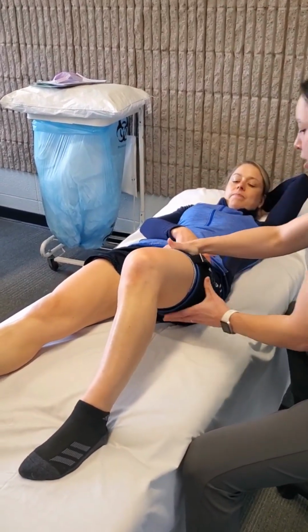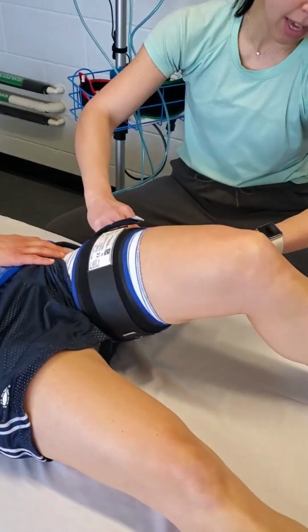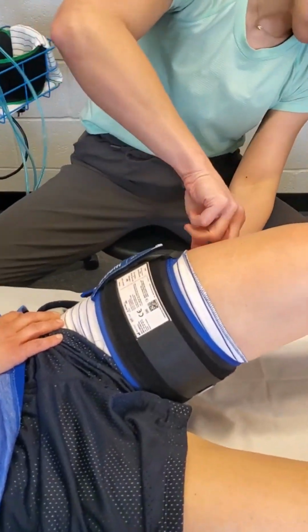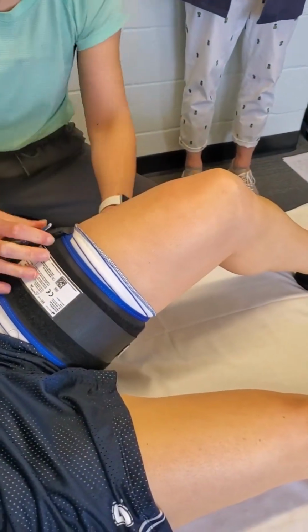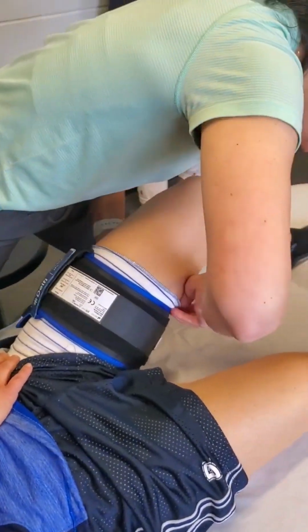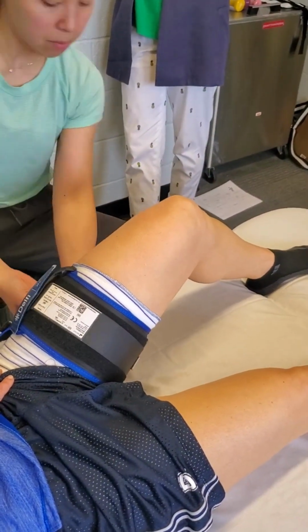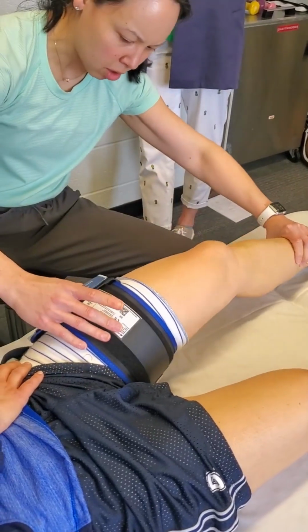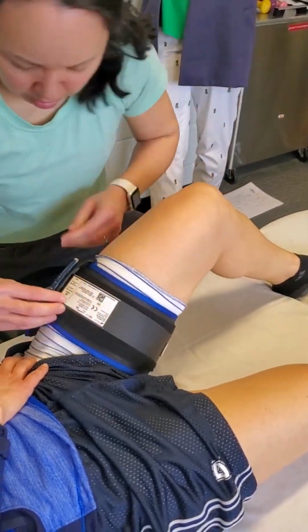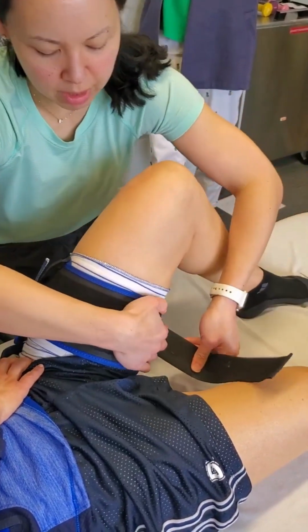And then really snug. So after I've done that, I want to come in and see if I can get 2 fingers in that way, and then just kind of ease this off a bit. Just want to make sure this is all the way around you, so it's not pinching. No pressure. So that might not even be tight enough for her. Keep your knee bent a little bit more for me for a sec. Yeah, that's perfect.